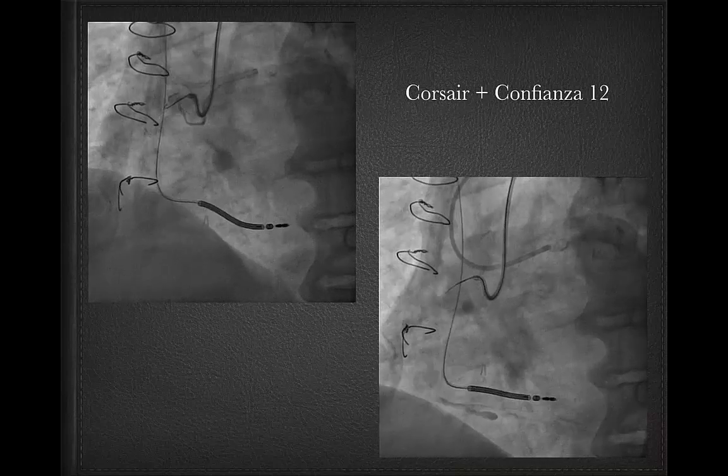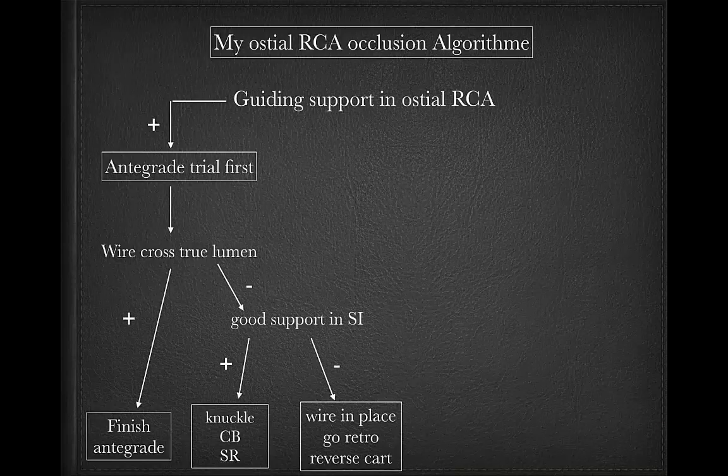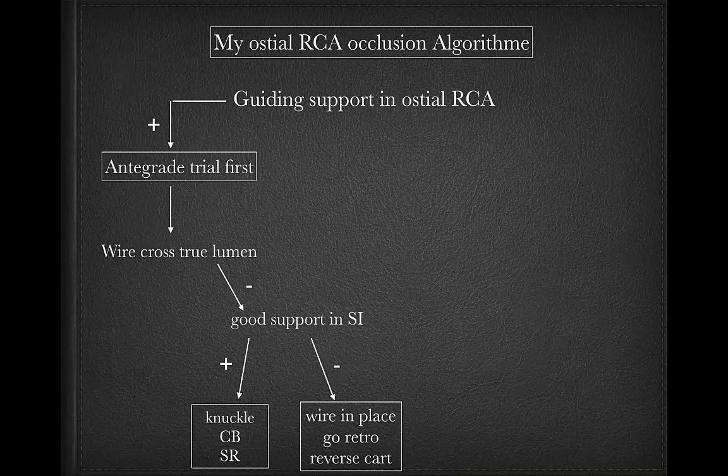So the question now is, do I have a good support in my subintimal space? If yes, I can knuckle and then use ADR strategy.